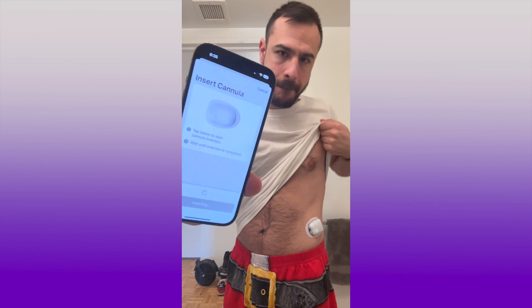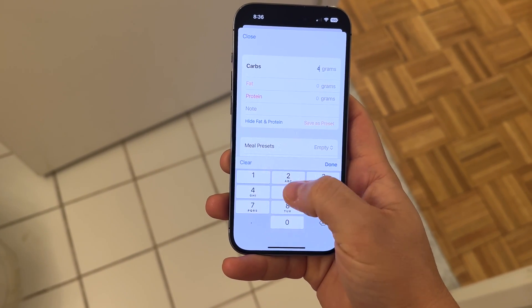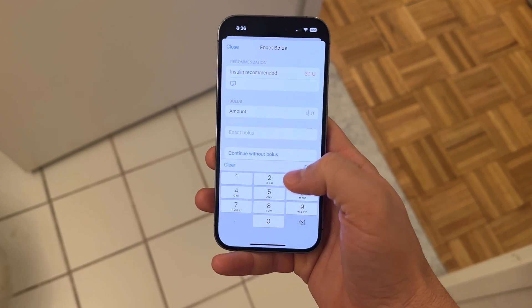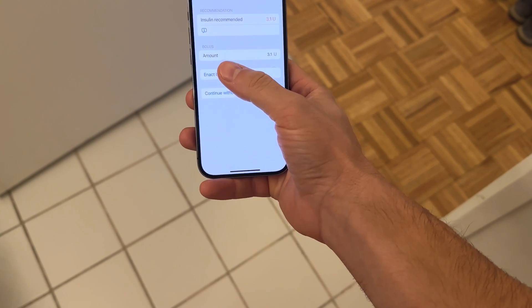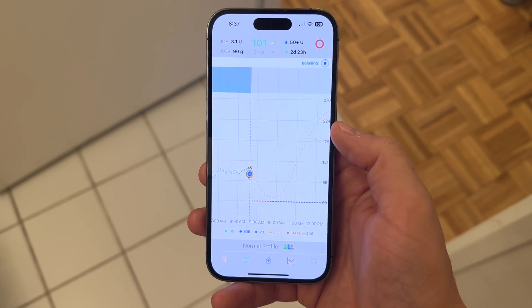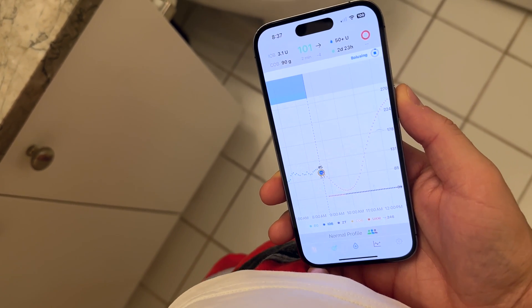Insert cannula. I'm going to log my breakfast, which is going to be 45 grams of carbs. Save and continue. Then it's going to recommend 3.1 units of insulin, and I'm going to enact bolus with Face ID. I got a confirmation on the pump. I'm actually going to turn that off because I don't like hearing the beeps. It's going. Math is happening.